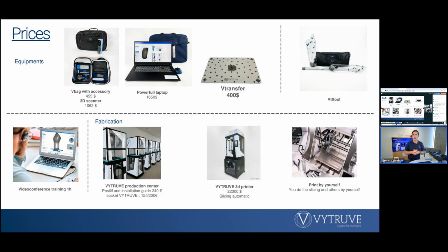What you can see is that you have 8 or 10 kilogram rolls, because it's important to print many sockets, many installation kits directly on these printers without changing the rolls often. You also have a box behind the printers to avoid humidity, because for 3D printers humidity is not good.